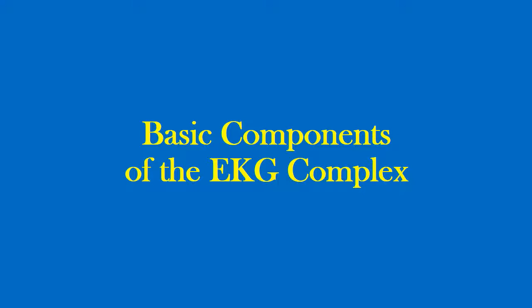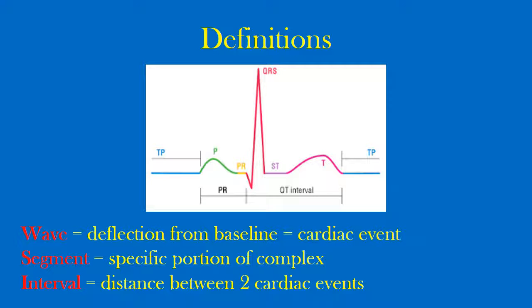In this lecture, we are going to look at the components of the EKG complex. We will begin by defining what a wave, segment, and interval are, and then proceed to look at each of these aspects of the EKG complex. So let's first begin by defining a few basic terms, as they will help prevent confusion.